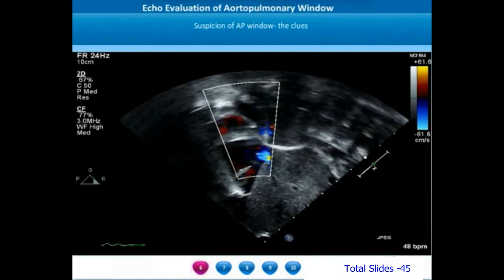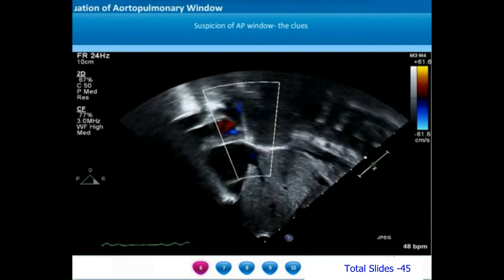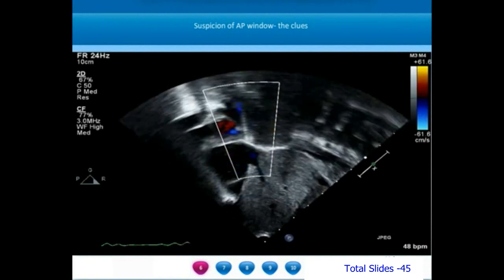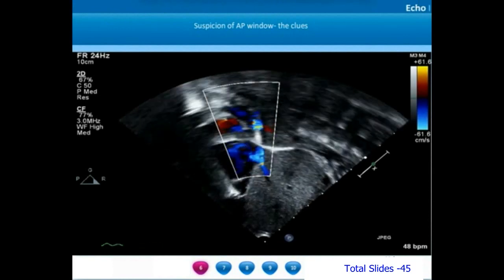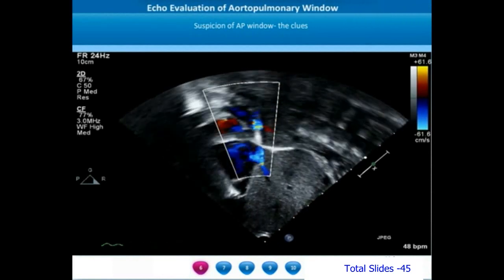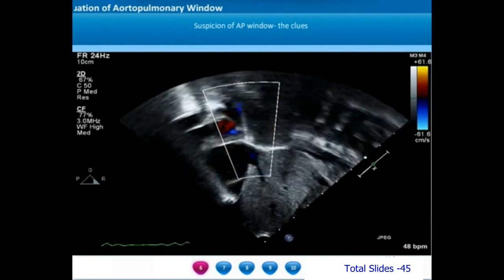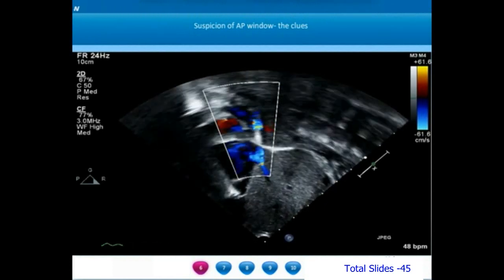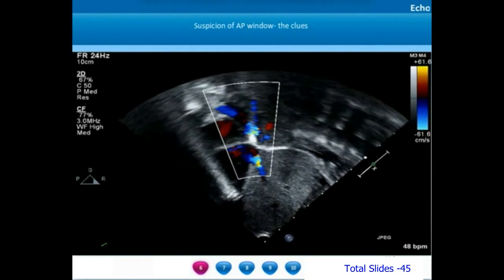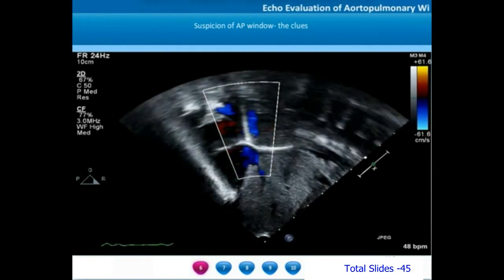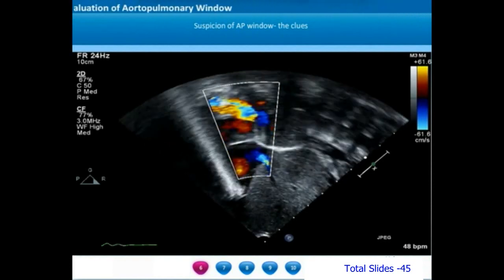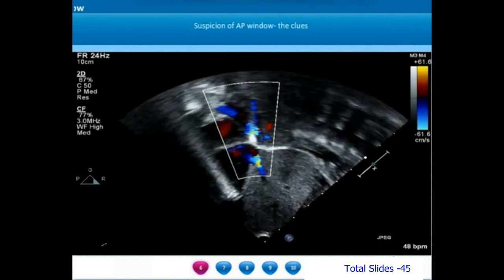One of the clues for identifying an aortopulmonary window will be flow reversal in the thoracic or abdominal aorta when we start the echocardiogram. In this subcostal view taken on short axis, behind the heart we are able to observe the descending thoracic aorta. If you carefully look at the color flow in the descending thoracic aorta, it is blue in diastole, which means the flow is going from below upwards — a flow reversal in thoracic aorta will be an indicator that there may be a proximal or distal aortopulmonary window.